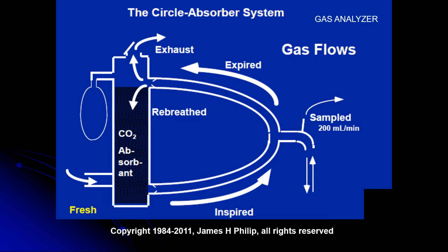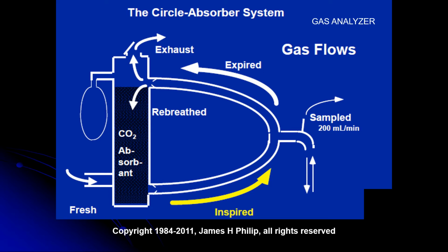Okay, now here the fresh gas flow obviously comes to the patient, then follow the yellow pop-ups, the inspiratory phase, here going to the patient, of course, then the expiratory phase, this one, of course, it's here, and you see the expired gas going obviously back through the expiratory limb.